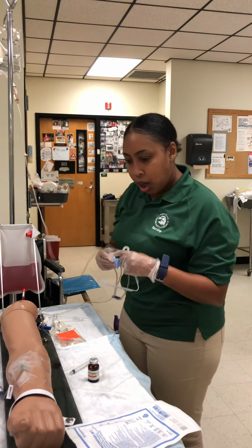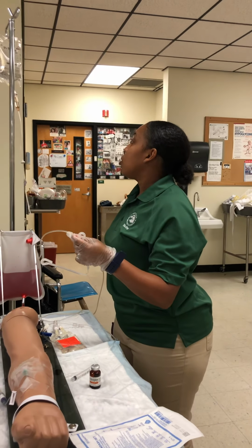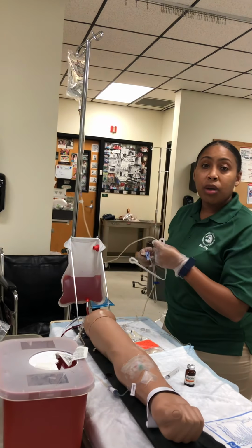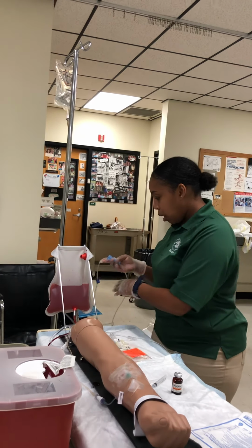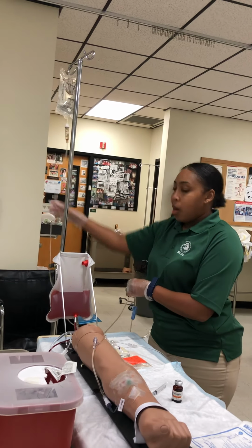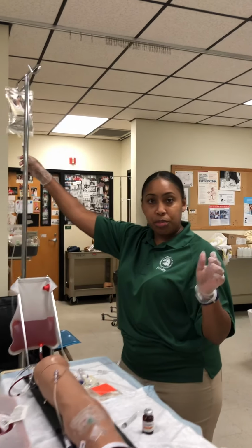We're gonna make sure that we document our IV piggyback and our IV push. We're gonna make sure that our patient had no adverse reactions, and we're gonna make sure we administer everything according to the right dose, the right route, the right time, the right medication, and the right patient. We're gonna use our 5 rights. And this concludes the video. Our primary drip is on the pump, and this concludes the video.